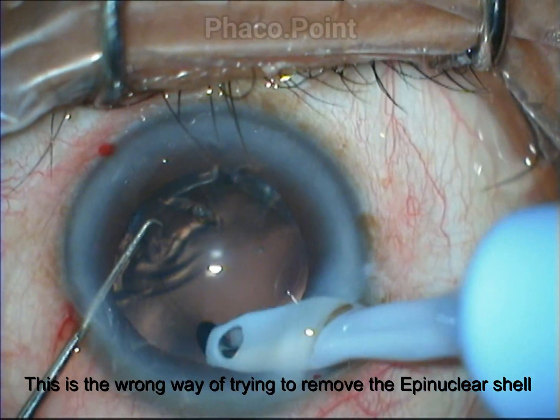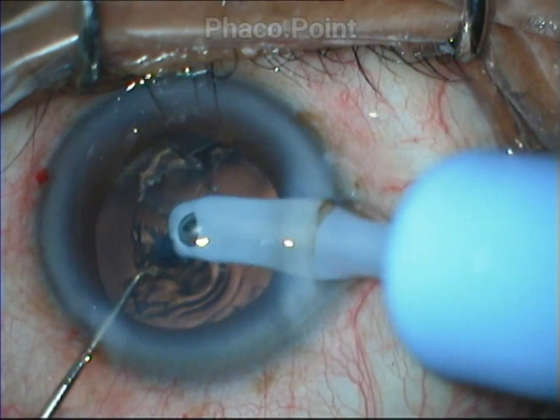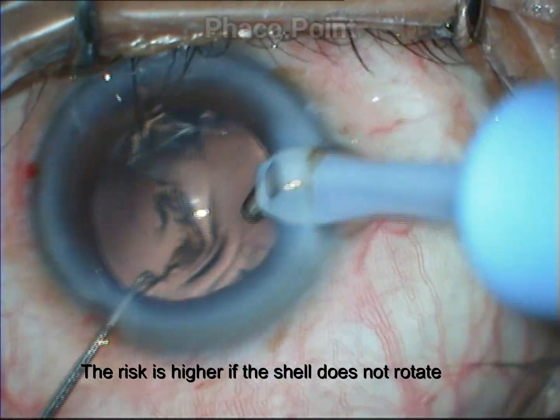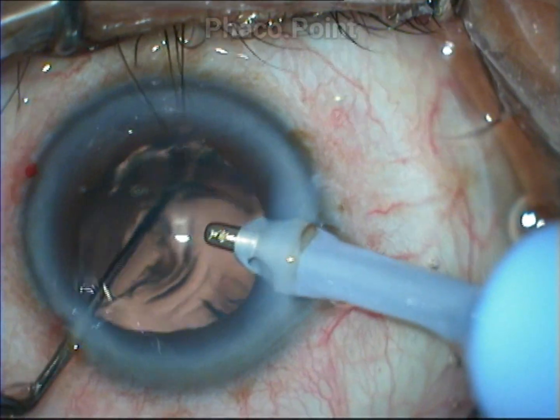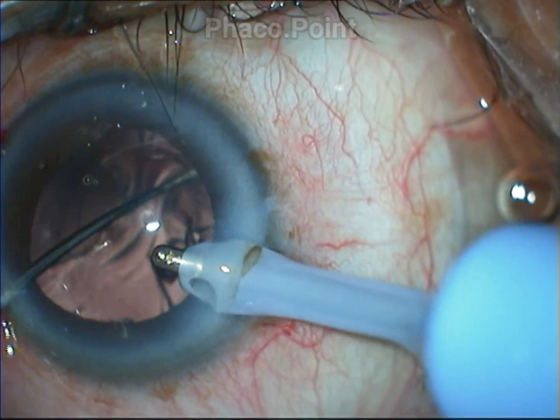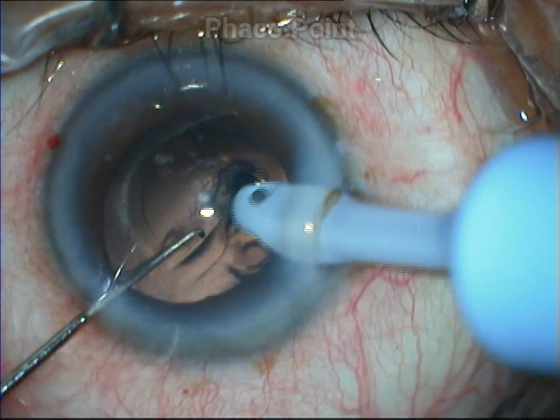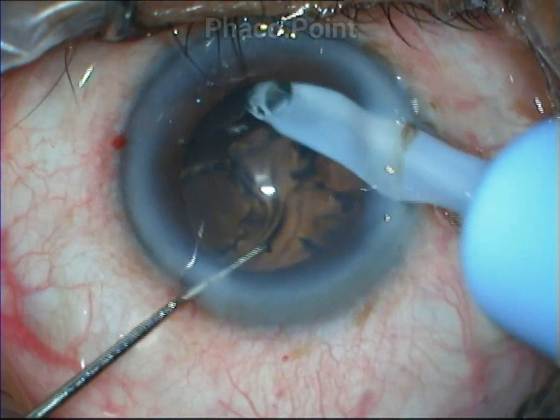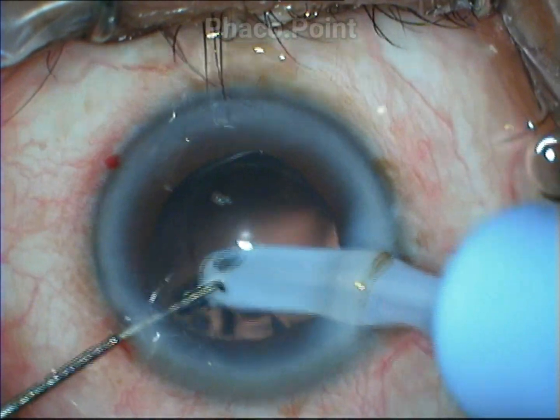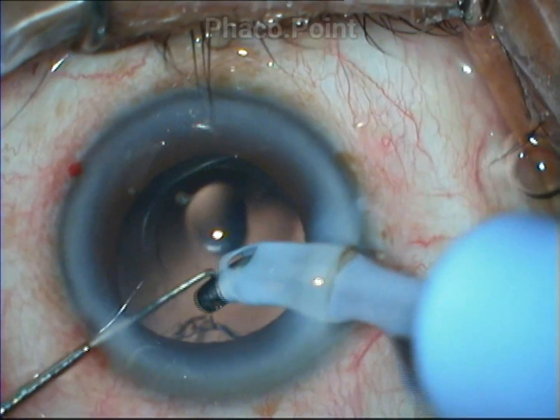The technique you can see is not the ideal technique by which the epinucleus shell is to be managed. What you see is an attempt at a totally haphazard way of removing the epinucleus shell, and trying to aspirate it in this particular fashion can predispose you to problems like zonular dialysis or a posterior capsular rent. And even though I succeed, I have put myself at great risk for removing this epinucleus shell.